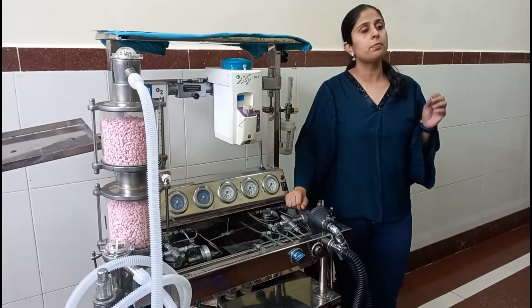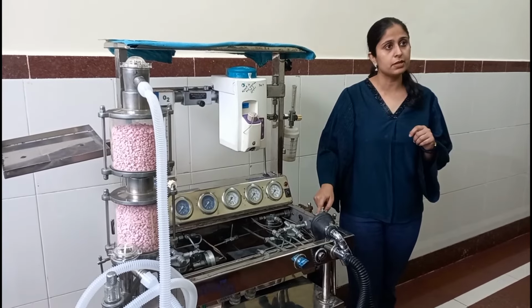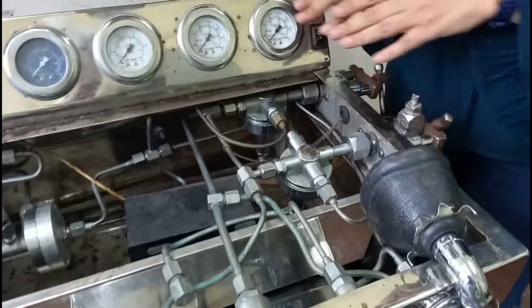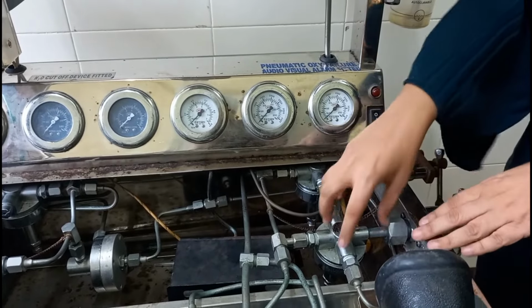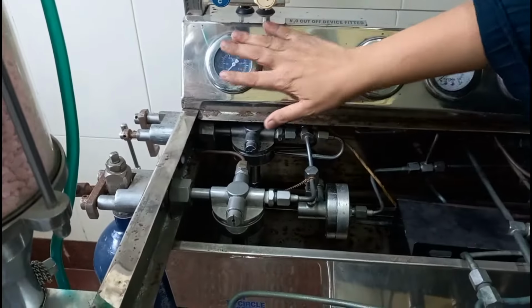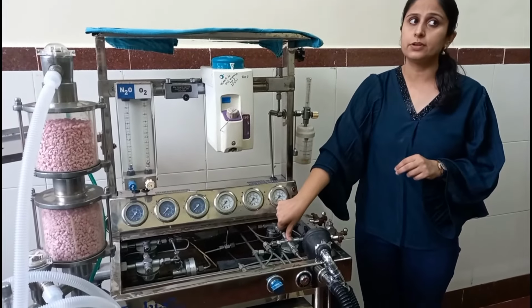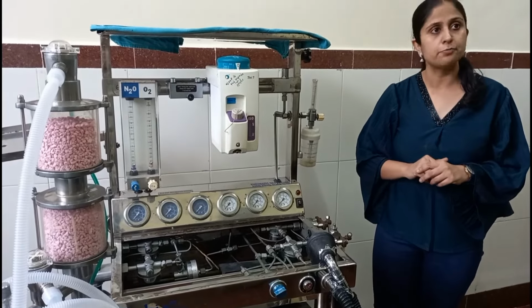Now first of all, what are the three parts of the high pressure system? The high pressure system includes the hanger yoke assembly, the pressure reducing valve, and the gauges. The hanger yoke assembly is for fitting the cylinder, the gauges tell the cylinder pressure, and there is the pressure reducing valve. This one, the pressure reducing valve, is for oxygen, and on the other side this pressure gauge is for nitrous oxide. So if three things are to be discussed in high pressure, it is the hanger yoke, gauges, and the reducing valve. These three things are included in the high pressure system.